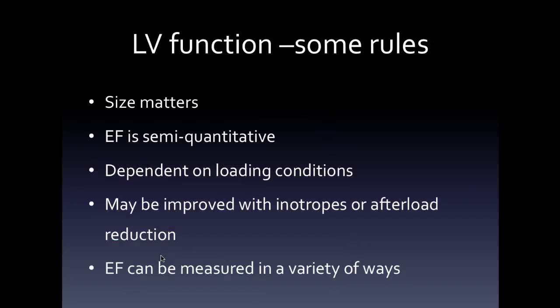When it comes to assessing LV function, size really does matter, because it's unusual, particularly in chronic states where there's decompensation, to have normal left ventricular dimensions with significant LV dysfunction. Of course, it can happen, and perhaps happens a little more frequently in the acutely ill patient. But left ventricular dimensions are critically important, and we keep coming back to those. It's also important to say that the left ventricular ejection fraction is semi-quantitative. To give it an ejection fraction of 36.2897% is absolute hogwash.